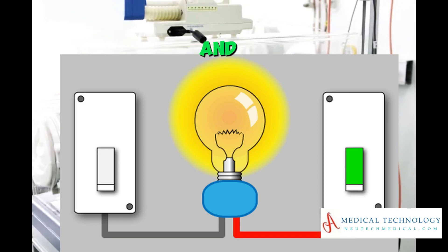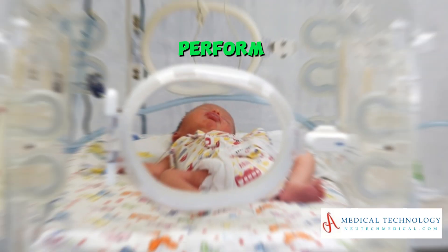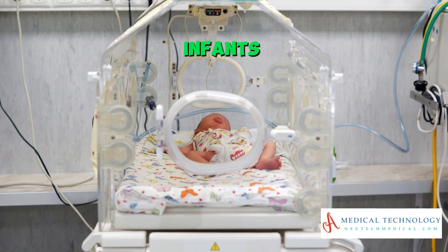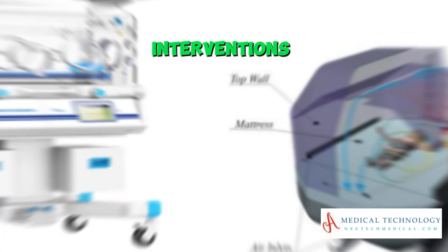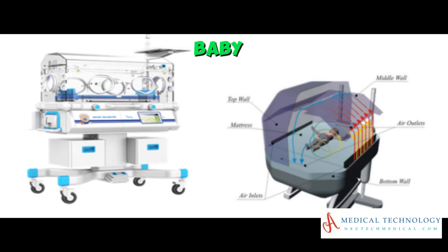Regular checks and documentation: Perform regular visual checks of the infant's condition. Document vital signs, interventions, and any changes in the baby's status.